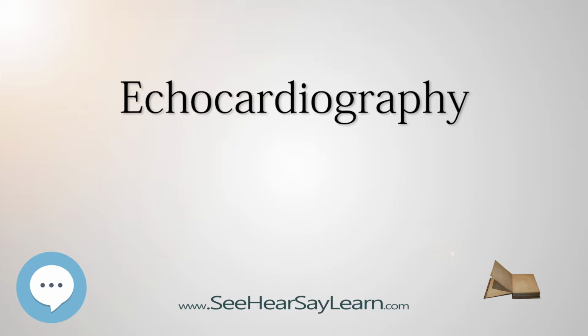Transthoracic echocardiogram. Main article: Transthoracic echocardiogram. A standard echocardiogram is also known as a transthoracic echocardiogram, or cardiac ultrasound. In this case, the echocardiography transducer, or probe, is placed on the chest wall, or thorax, of the subject, and images are taken through the chest wall. This is a non-invasive, highly accurate, and quick assessment of the overall health of the heart.